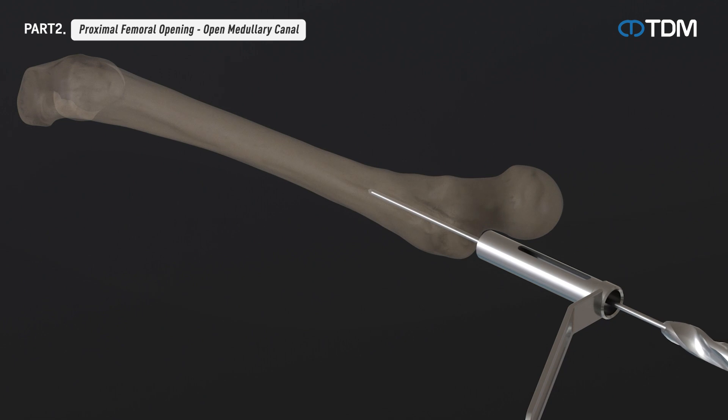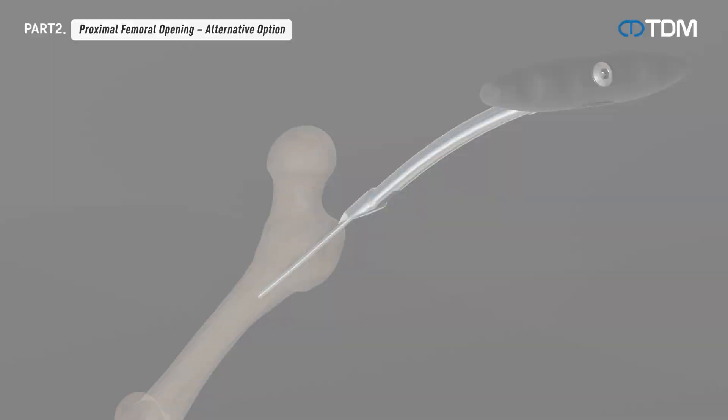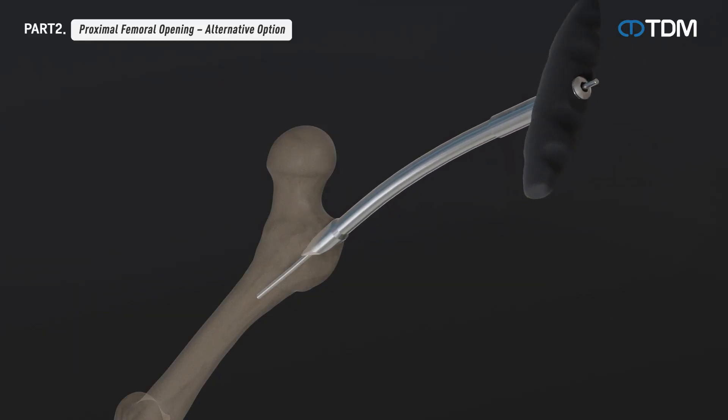Remove the drill sleeve and insert the open reamer along the guide pin. Drill until the head of the reamer reaches the proper position, then remove the open reamer and guide pin in turn. This is one method of alternatively opening the medullary canal.